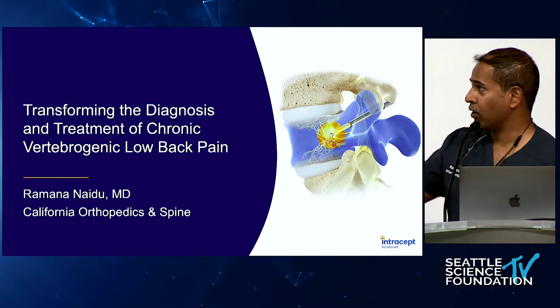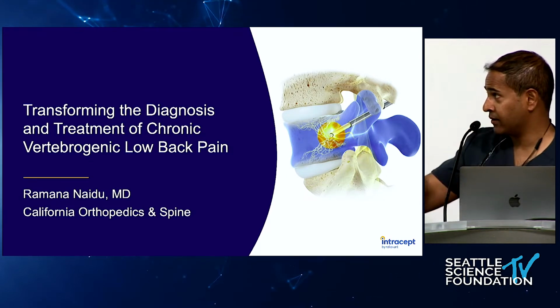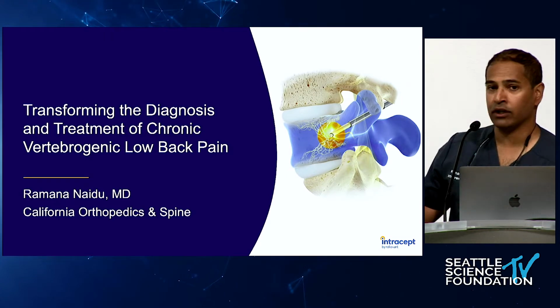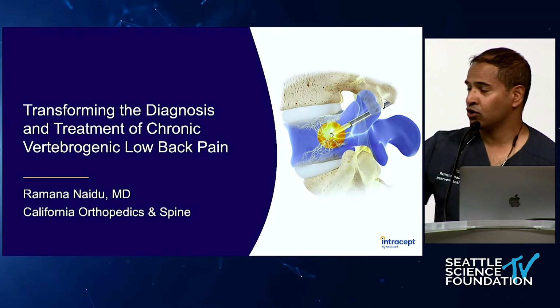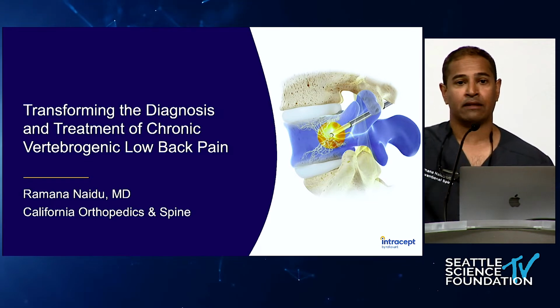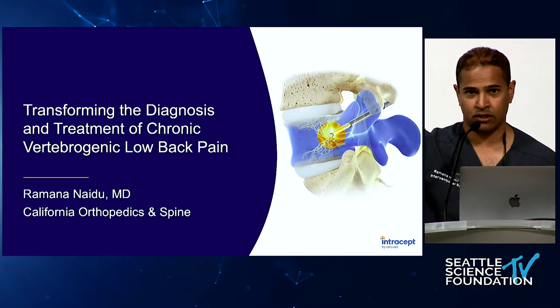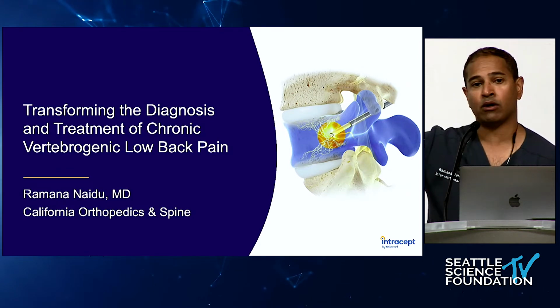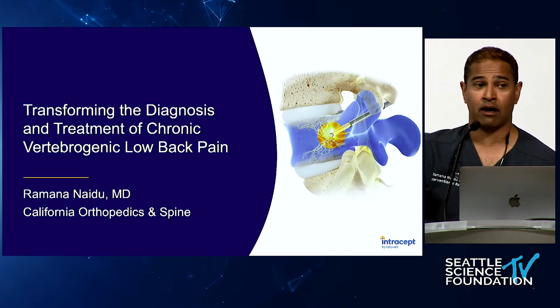So a lot of the work started about 20 years ago and has really evolved with the work of Fields, Lotz, et cetera. And Lotz is at UCSF, as you know. And so looking at this nerve as really the transmitter of nociceptive signal from the end plate to the spinal cord and up to the brain is how we're looking at this. So the way I look at this procedure is basically like the genicular nerve for the knee, right? So the disc is a joint. Doug has talked about intradiscal or intra-joint, intra-articular procedures, therapies, et cetera. Now we're talking about the nerves that innervate a lot of that joint, not the entirety of the joint, but a lot of that joint.